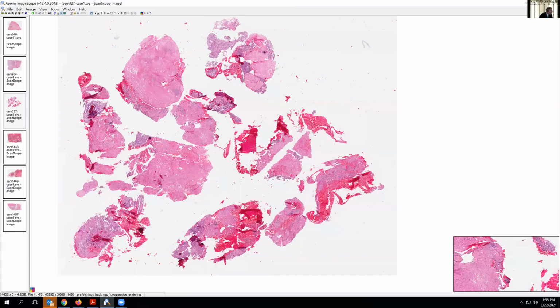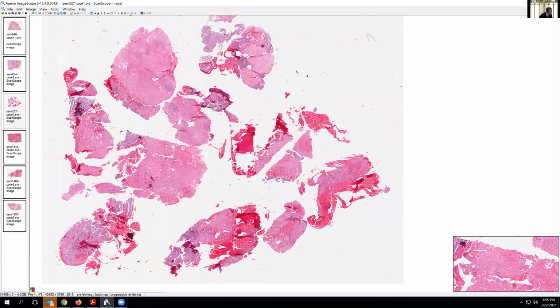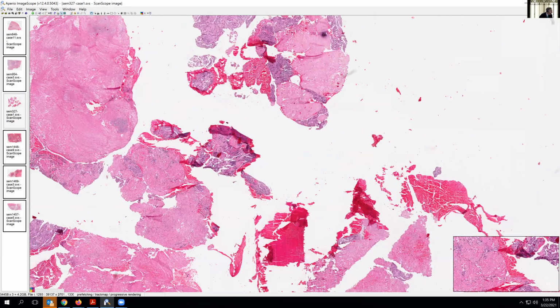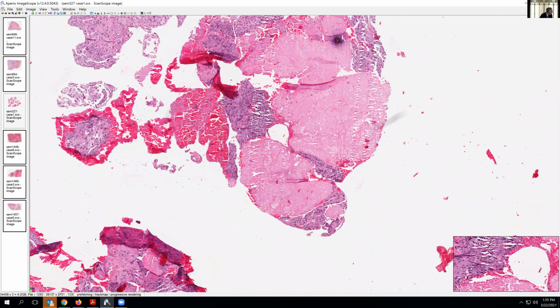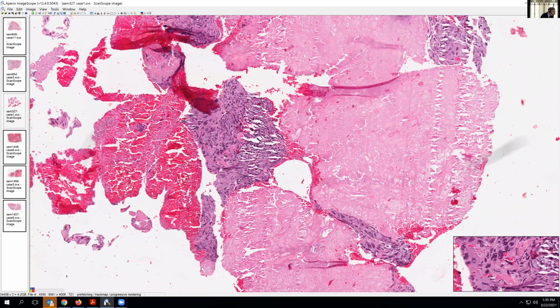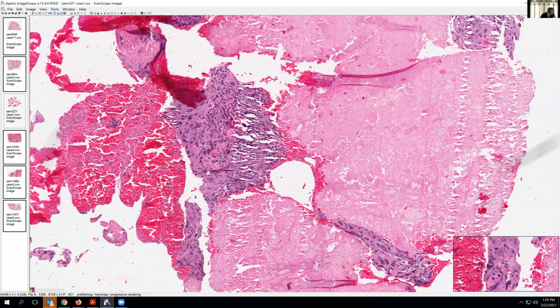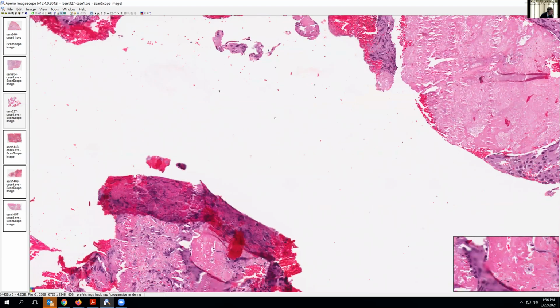But what would this look like if we were looking at a post-curettage sample rather than a metastasis? Well, here's an example for us, and we can see as we come in here that we have a lot of fibrinoid necrosis. We have a little bit of cellular tumor here as well. And as we look at this, we can see that, again, we begin to see this multipartite morphology of different types of cells, a high degree of pleomorphism. We'll go here a little further.